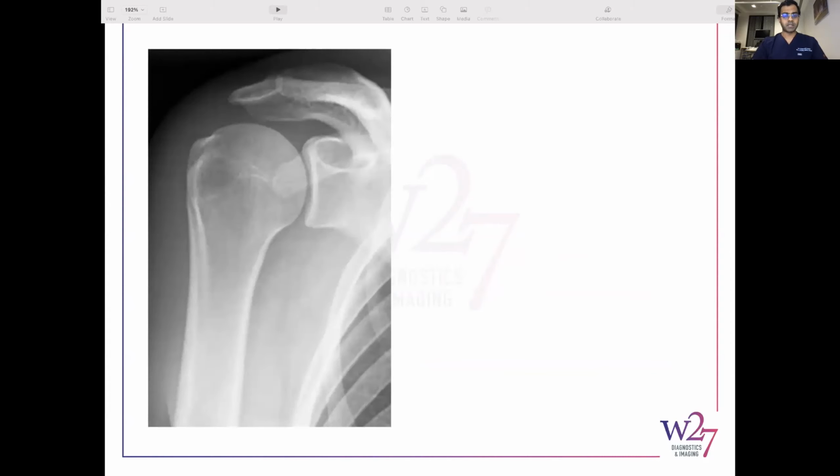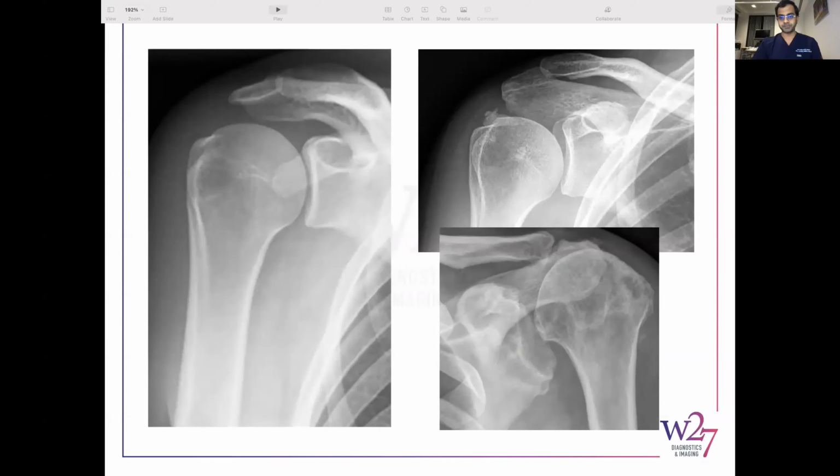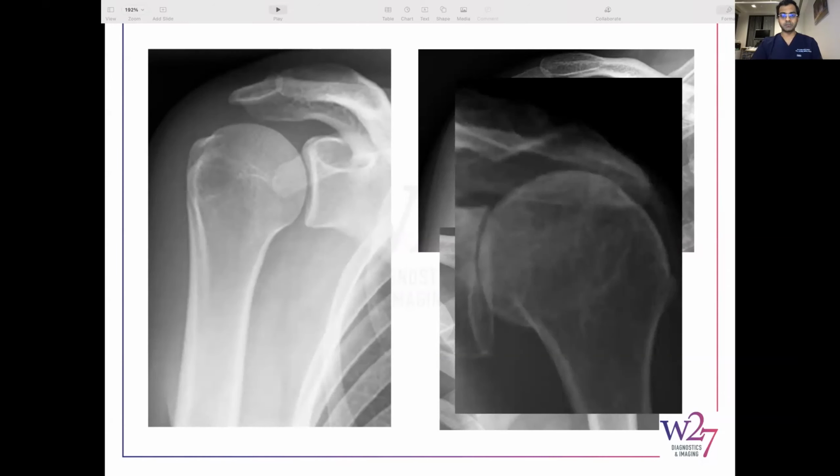Here's an X-ray that I'd like to see in a frozen shoulder. This is a normal X-ray of the shoulder where I can rule out any alternative causes for pain here. Here's an example of calcification overlying the rotator cuff, outlining the supraspinatus. So here's a patient that presented with calcific tendinopathy. Here's a patient that's got a full thickness rotator cuff tear, and I can tell that because you've got abnormal superior migration of the humeral head, and you've lost the normal acromiohumeral interval.